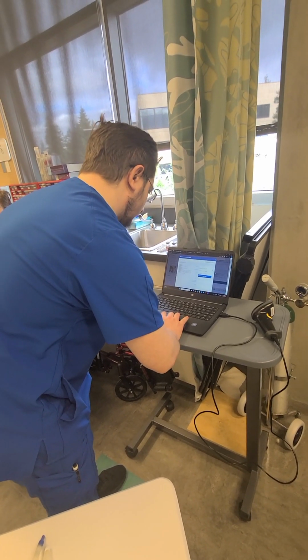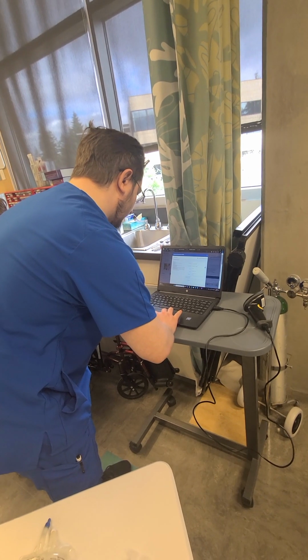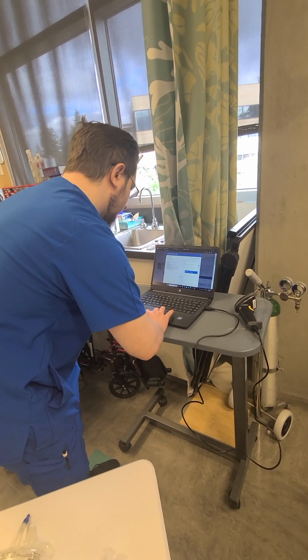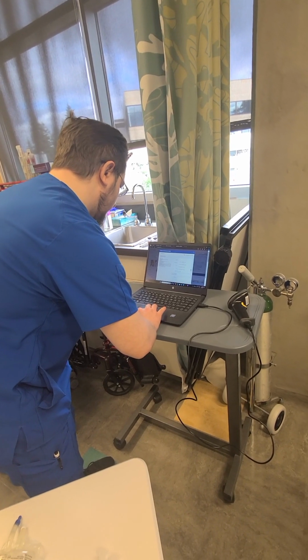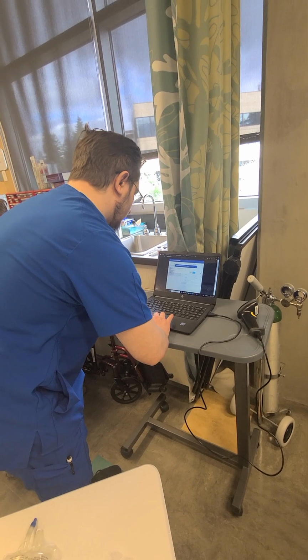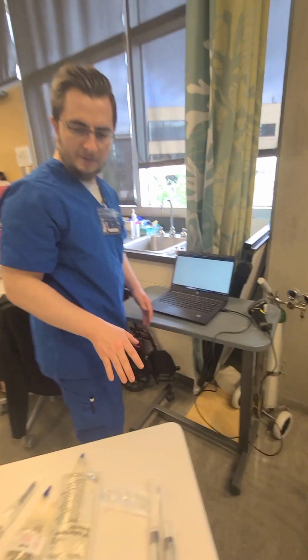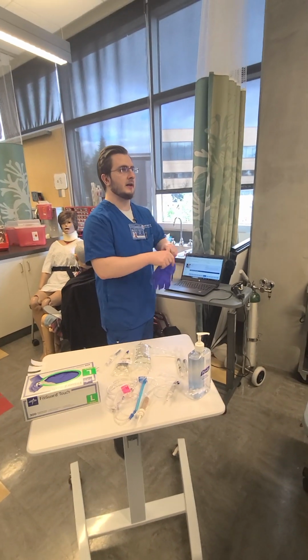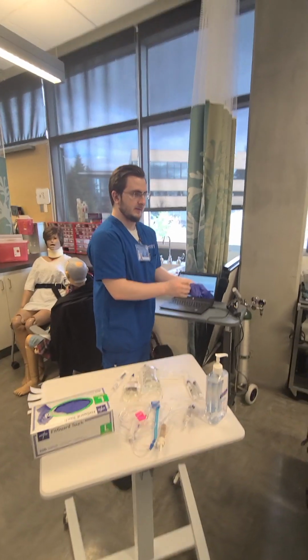And then location, the left upper arm where the IV is at. Good. Everything's scanned in. All right, Erica, I'm going to give you your Zofran first, and then I'll hang your IV antibiotic. Is that all right?